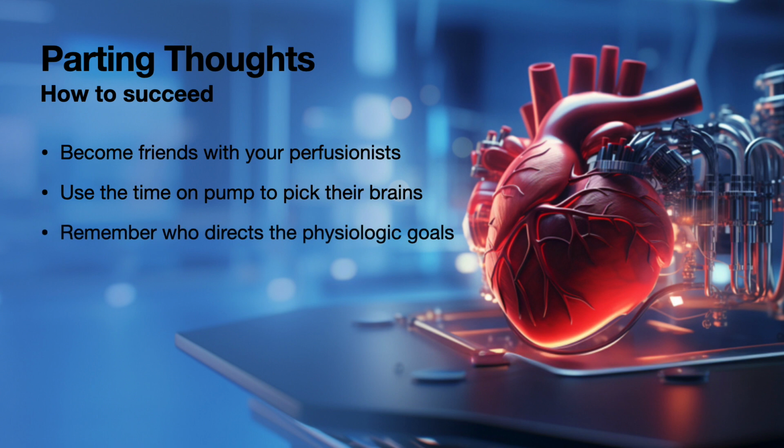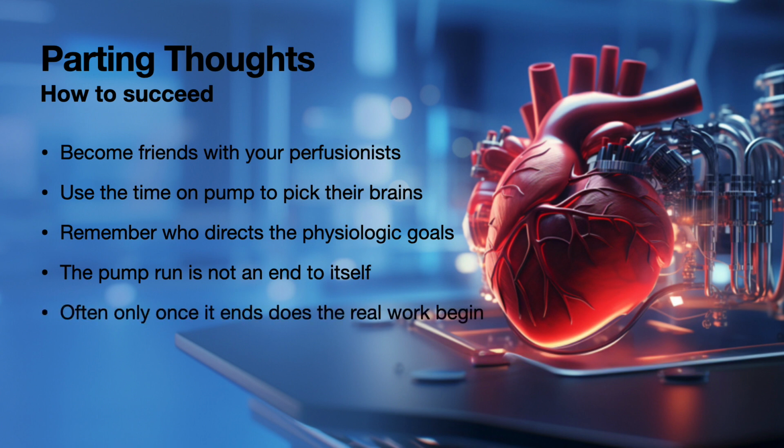Don't ever forget that it is the physicians who direct the physiologic goals for the pump run. Putting the patient on pump does not allow the anesthesiologist to abdicate their responsibility for the patient's physiology. The pump run is not the goal. It is merely a technique used to allow the surgeon to execute the surgical therapy for which the patient is on the operating table. In many cases, the real work for the anesthesiologist only begins once the pump run is complete and you are left to deal with the very real consequences of this essential component of modern cardiac surgery.